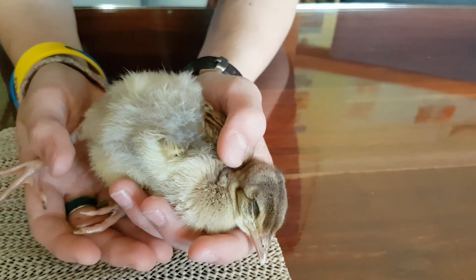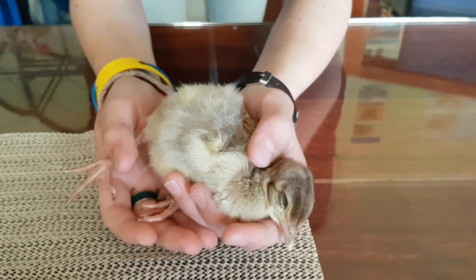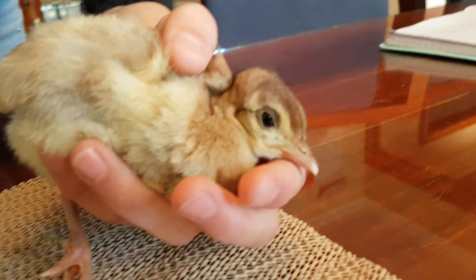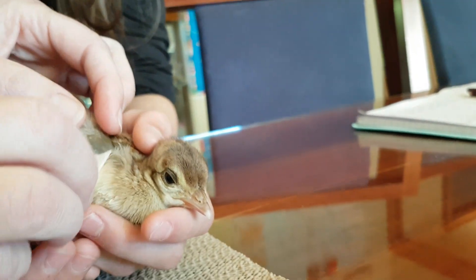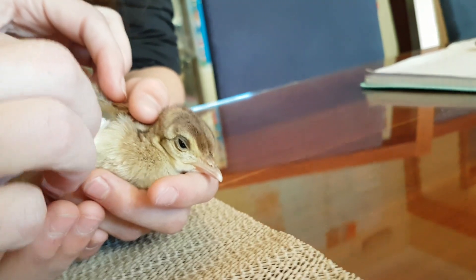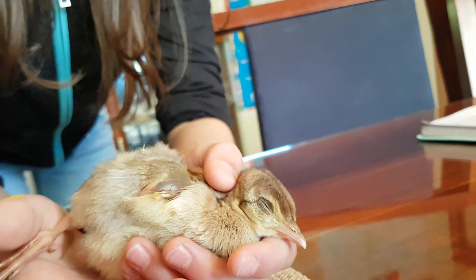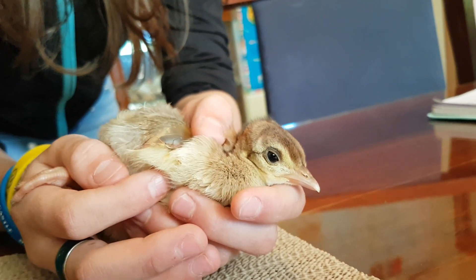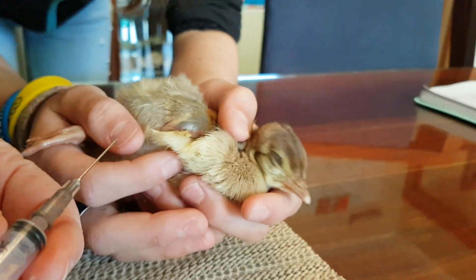So we'll go in there and draw some of the air out with a syringe. I'm just kind of nervous. If you come round a bit, you'll be out of the line. I've been calling her Indy, so I've called it Indy Popper. You might have to look away when you put the needle in. I'm not looking forward to doing this. This is a .22 needle, so it's quite a large gauge because I wanted the air to be able to come out.